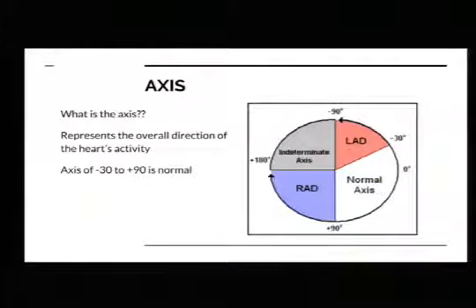So your axis is basically the overall direction of the electrical activity of your heart. The reason normal is clear down over here is because if you picture your heart laying on here, the left ventricle, the biggest part of the heart, is sitting down here. So the overall axis should be heading in that direction. If you're clear up here, that means there's more of the heart sitting up here. We'll go through all the reasons, but that means your vector's heading up that direction.